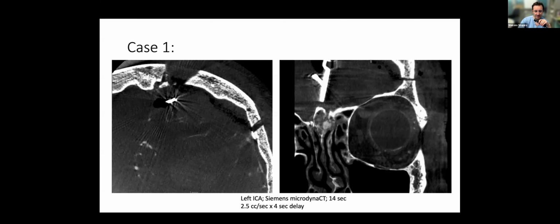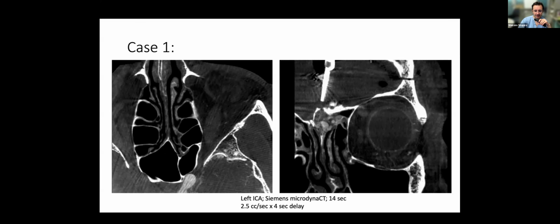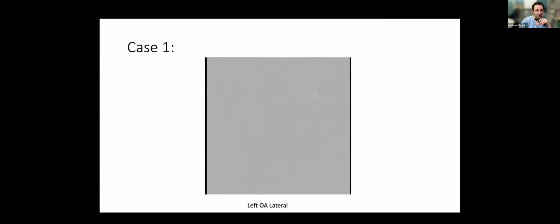Now, if we look at the post-procedure images, I had a couple of comments. First, you mentioned that there was a blind pouch. I don't think the pouch is blind. If the pouch were blind, I think... You mean post-surgery, Max, right? Post-surgery. If the pouch were blind, things would be different.